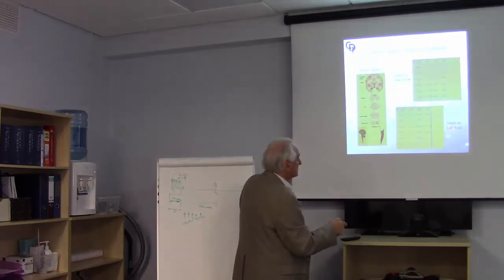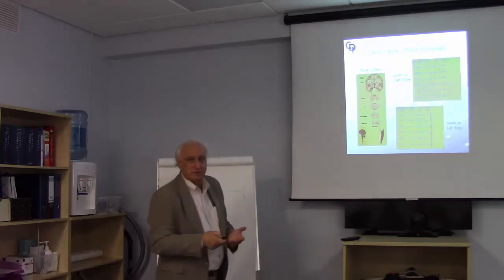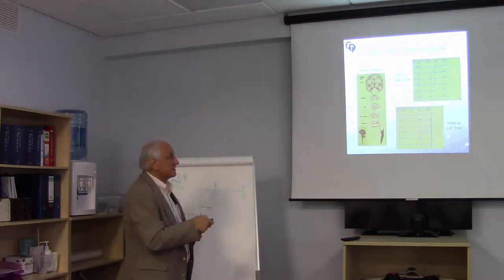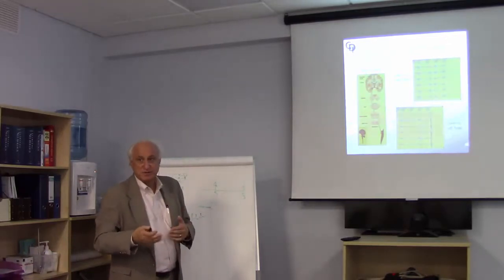Then we reversed, flipped the anode, and we're getting muscle groups on the right side. This is the upper extremity, lower extremity, and nothing from the left side. So that's pretty much what you expect to see. And you shouldn't be surprised if you see this kind of activity, because that's the standard thing you're going to see in most patients.